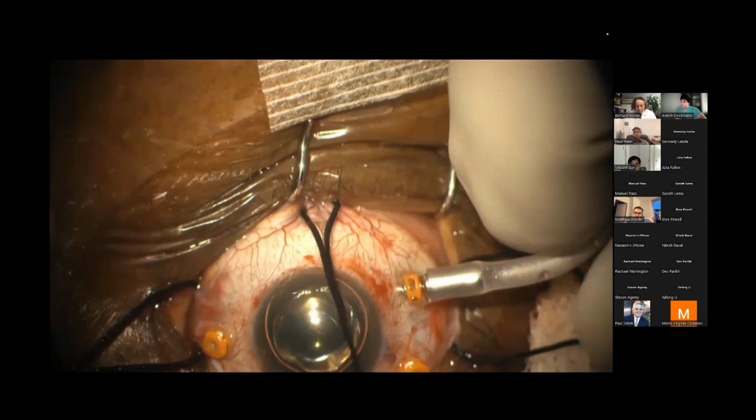But you have to balance that between not squeezing the eye and making it into an hourglass. But you definitely will, as the buckle height increases, gather up more of the retina. So you'll pick up that posterior edge. Mm-hmm.